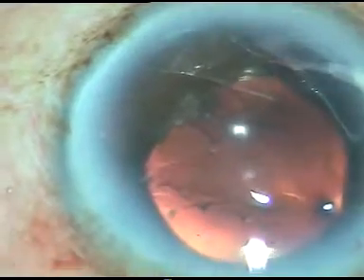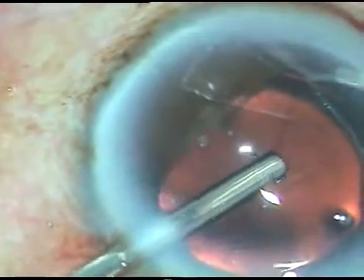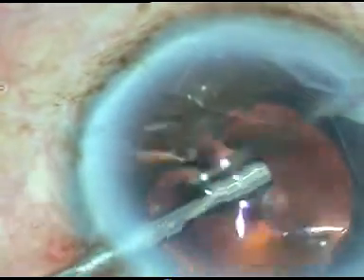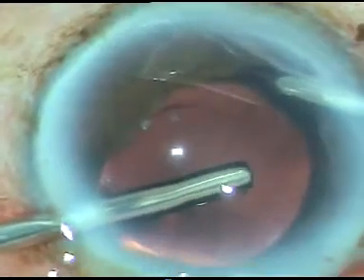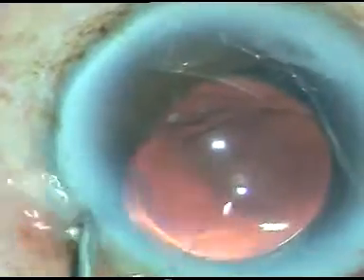Now I have taken the vitrectomy cutter — this is the Alcon vitrectomy system — and I want to trim the iris tag. Here it is. I just turn to that side and trim the iris, then turn back and gradually come out. It looks nice now.